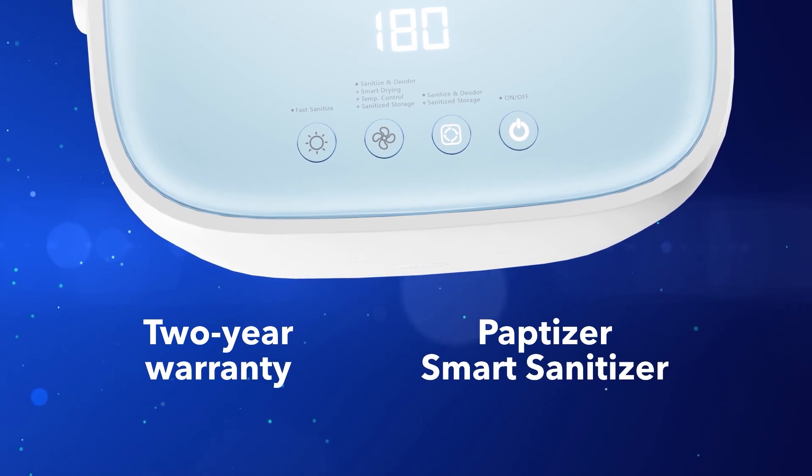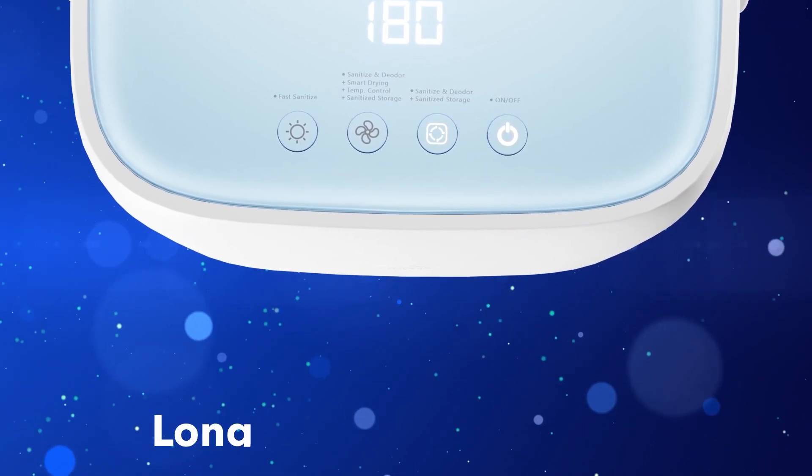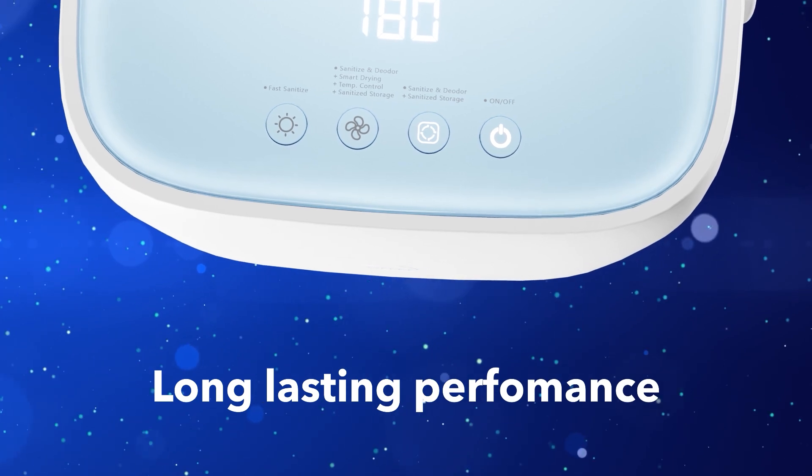With a 10,000-plus-hour LED lifespan and 2-year warranty, the Paptizer is built to offer long-lasting performance and peace of mind.